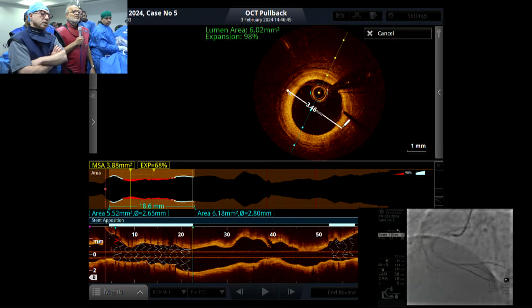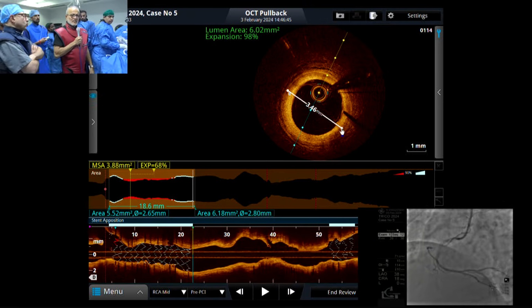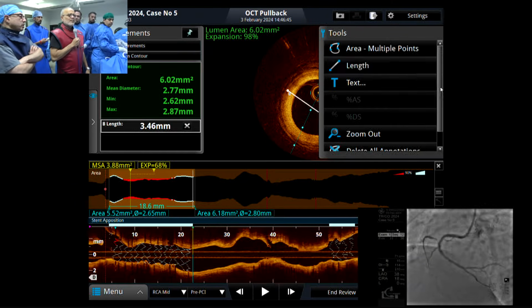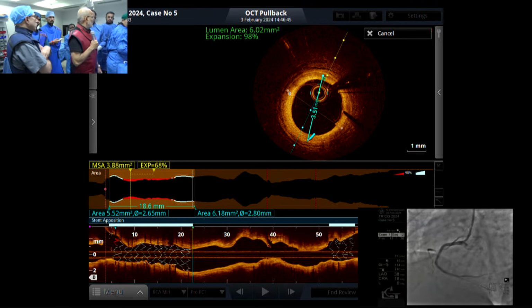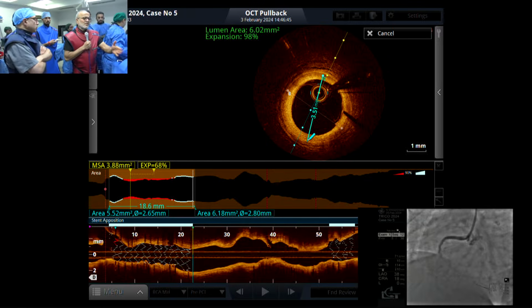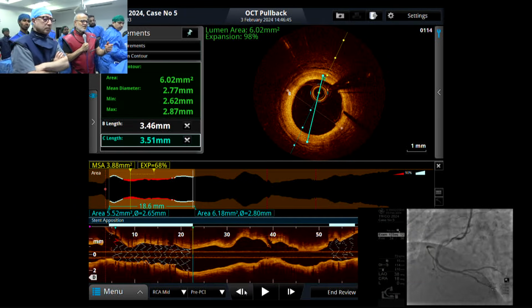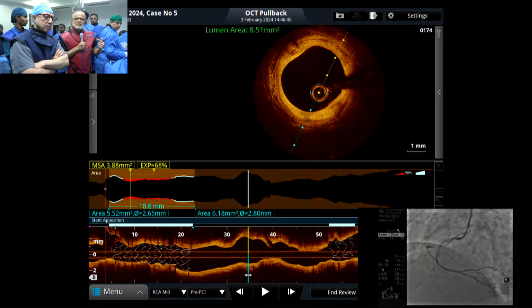I think a 3.25 at high pressure. 3 to 3.25, but if it's not available, you can take the 3.5 short, just to close the struts. Come to the proximal part. So let us do the distal. We're going to do a 3.25 balloon, 12 mm.